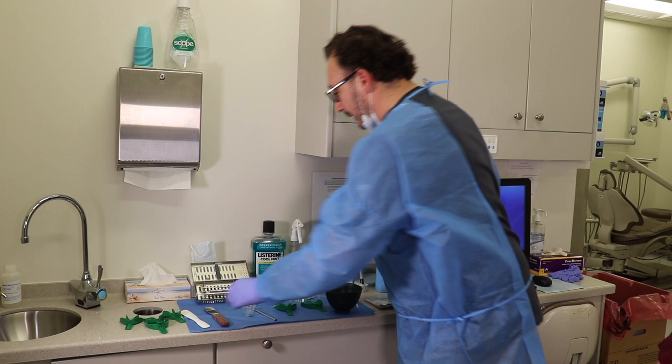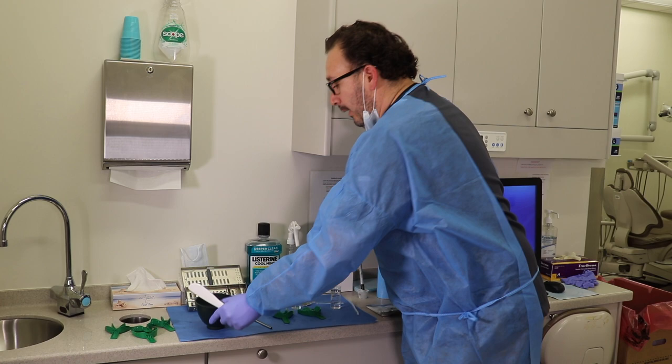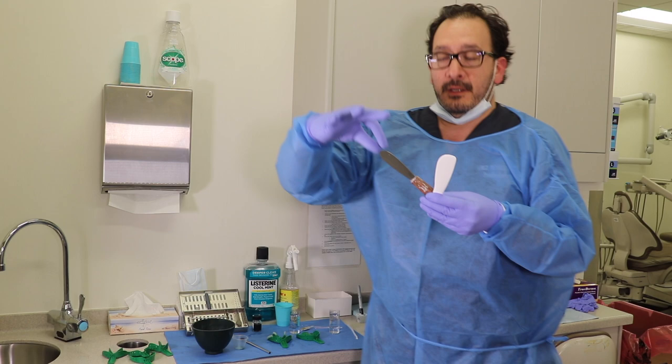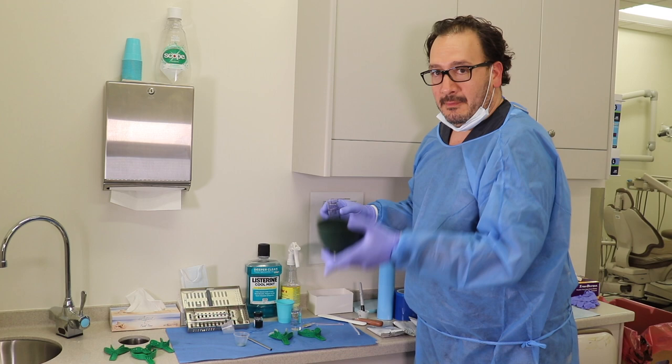Then we use the dark bowl, okay, which is stiffer. And this bowl is specifically made for alginate. And we got two different kinds. Well, actually, we got three different kinds of spatulas. The wider spatulas are made for alginate. The thinner ones we have are made for stone. In this case, what I'm going to do, can you see it very well there, Marco? Yes? I want to say thank you to Marco, my camera guy, this time.